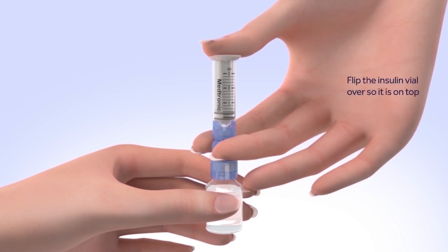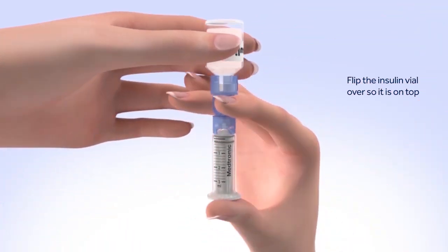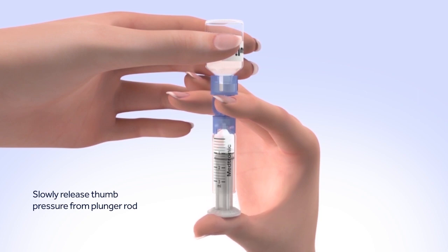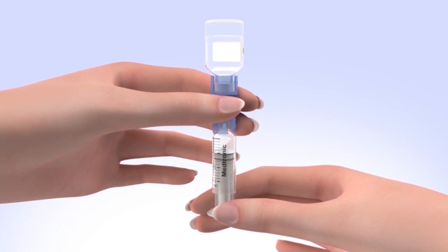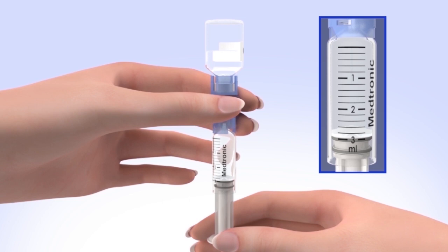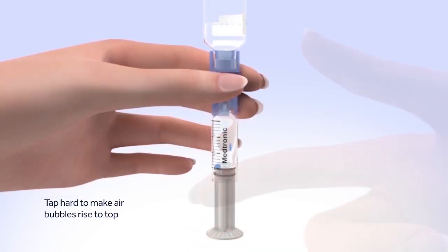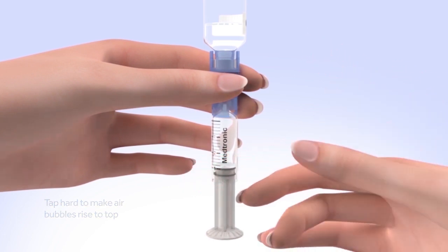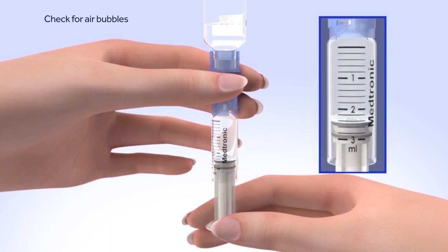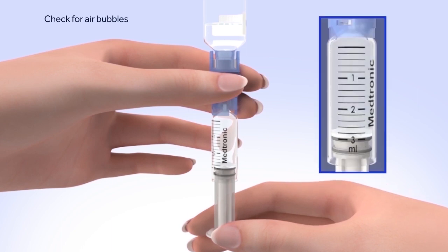Flip the insulin vial over so it is on top. Make sure you are holding the vial with your other hand. Slowly release your thumb pressure from the plunger rod, and the reservoir will start filling with insulin. When the reservoir stops filling, slowly pull down on the plunger until the top black O-ring lines up with the desired amount. Keep in mind, every small line on the reservoir represents about 20 units of insulin. Tap the reservoir hard enough to make the air bubbles rise to the top. Slowly push up on the plunger rod to move the air bubbles back into the insulin vial. Pull down on the plunger to fill the reservoir to the number of units desired. Repeat as needed until air bubbles are removed from the reservoir.